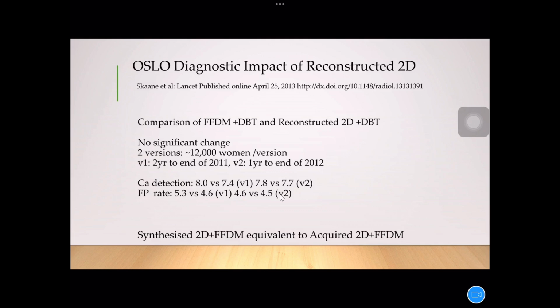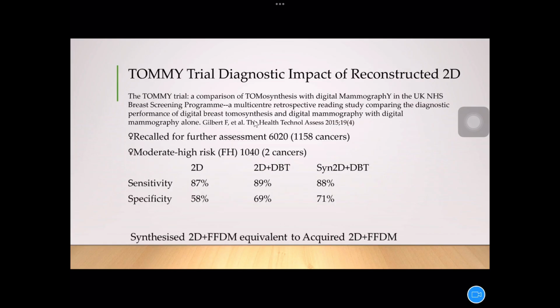So they were equivalent. The same thing was actually shown in the Tommy trial, where in the UK they recalled women to assessment and compared the acquired 2D with the synthesized 2D, and they basically got the same results. So it clearly works if you've got a good quality synthesized image.